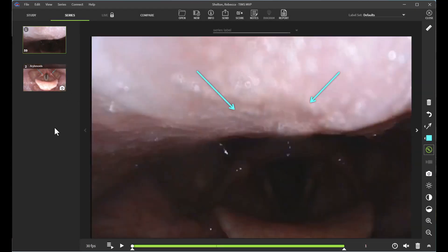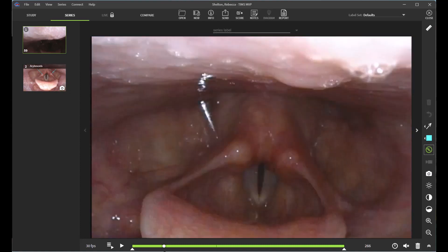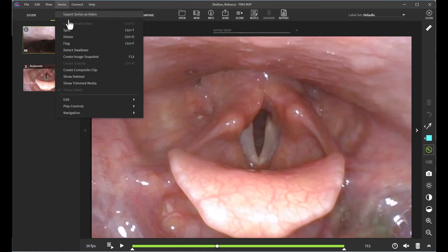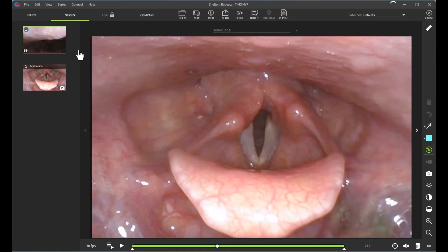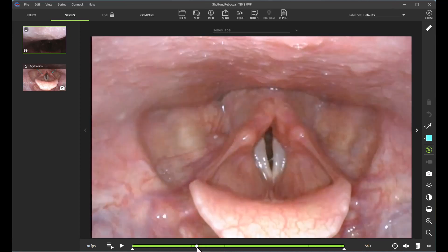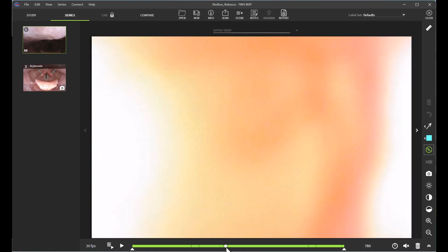Another feature discussed in a previous video is the ability to assess where swallows happened. I can turn this on by clicking the Series tab and clicking Detect Swallows. As you might notice, there are little gray lines appearing along the timeline — this is indicative of a swallow occurrence. This helps make the editing and reviewing process faster for those recording the entirety of a FEES study without stopping between trials.